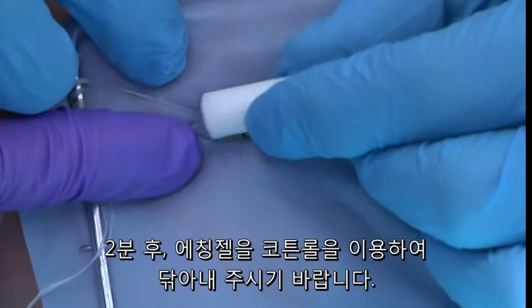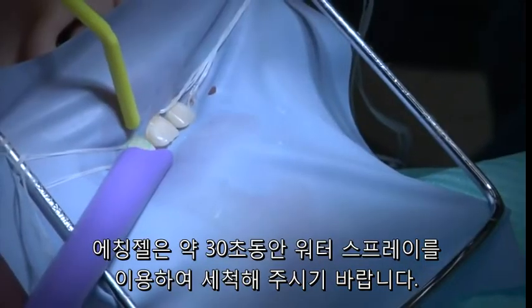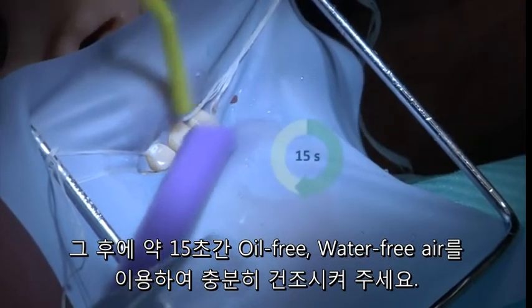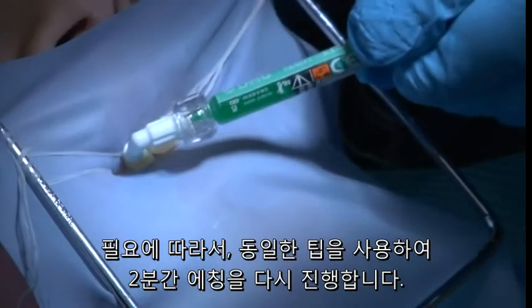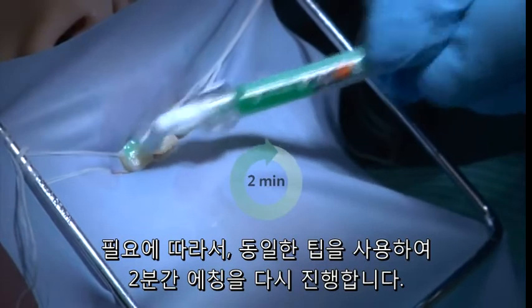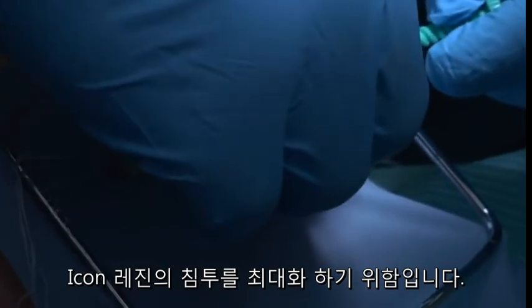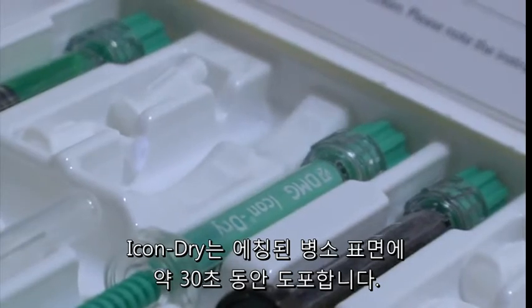Care should be taken not to allow the acid to flow onto the gingival tissues or onto non-treated tooth surfaces. Excess etchant can be removed with a cotton roll. At the end of the two minutes, the acid is gently rinsed from the surface with water spray for 30 seconds and then dried with oil-free and water-free air for 15 seconds. A second two-minute etch step is then indicated — the same applicator tip can be used again. Then, in order to allow for complete desiccation of the enamel and to maximize penetration of the ICON resin material, an ethanol solution, ICON Dry, is applied for 30 seconds over the entire treated surface.